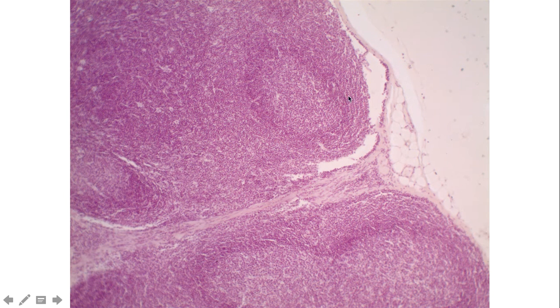And so if we take a look here at these two follicles, this again is the cortex region, right? The outer area of the lymph node just inside the capsule is the cortex. And the cortex is going to have these very defining features, these lymph follicles. And you'll notice that these follicles have this outer dark purple area, and then they tend to have a lighter center. And this lighter center is referred to as the germinal center. And really what these structures are composed of are a bunch of lymphocytes, and specifically B lymphocytes.